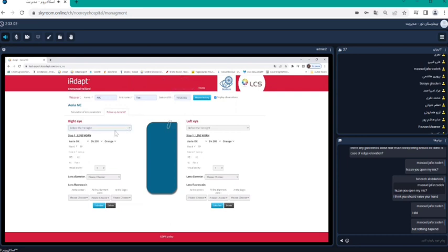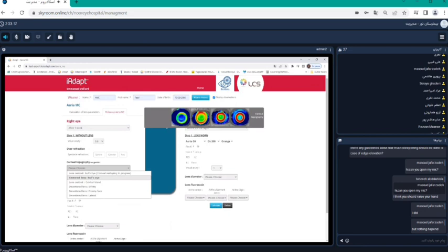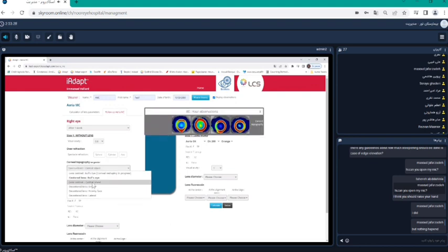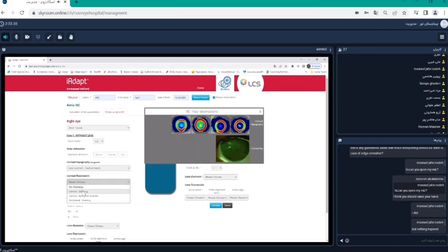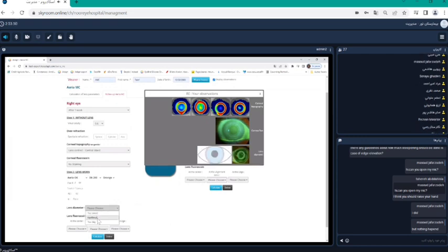When you have received an ortho-K lens and you say, well, I see the patient after 1 week, you also have a menu where you just have to specify what you see. For example, you specify the topography after 1 week. Is it like that, or like that, or like that? If you say it's like that, then it asks you about the corneal fluorescein. Do you have no staining, or a slight staining, central staining, peripheral staining? Then, what about the total diameter? Is it optimal, or is it like that, or like that?